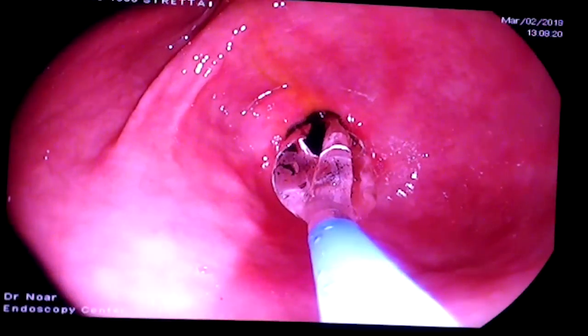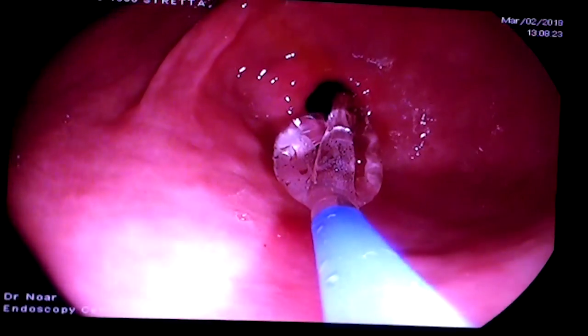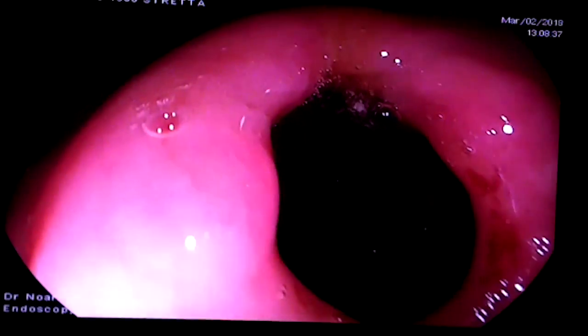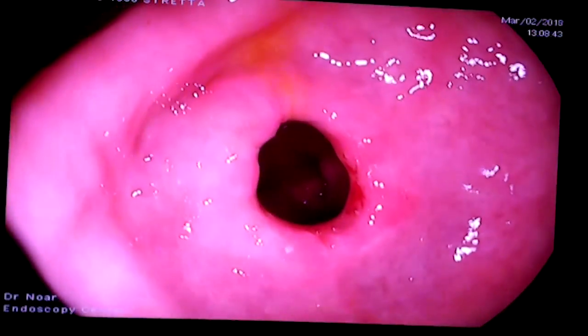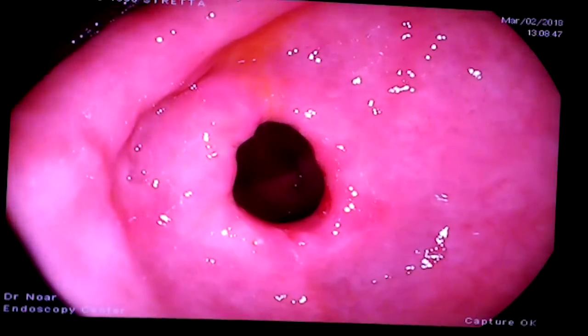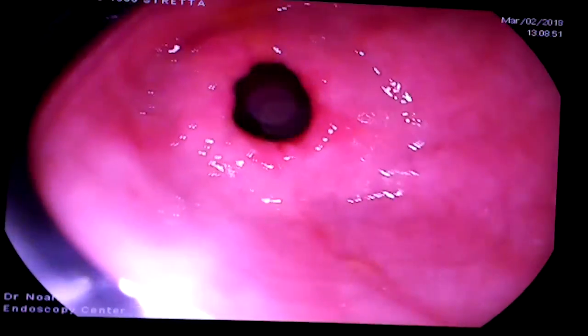This will go back up again to full pressure for another two minutes. Then we take the balloon back down again and do a quick inspection. You'll always see a small amount of tearing, and you'll see that the tissue stays open widely. Get another balloon. You can turn those lights back off right now.